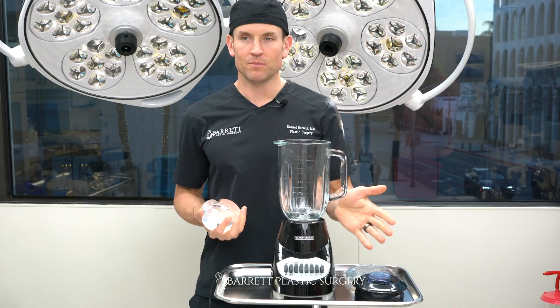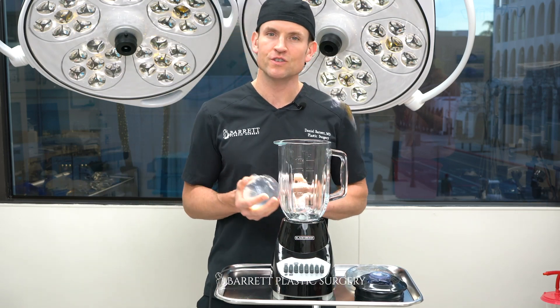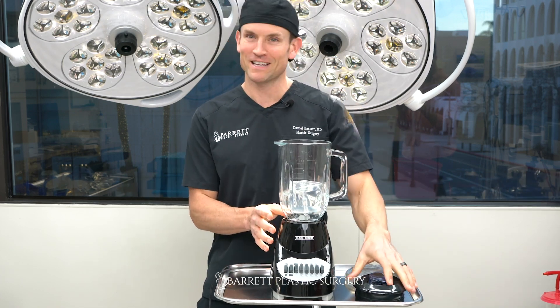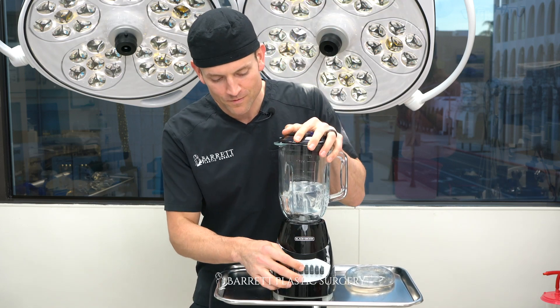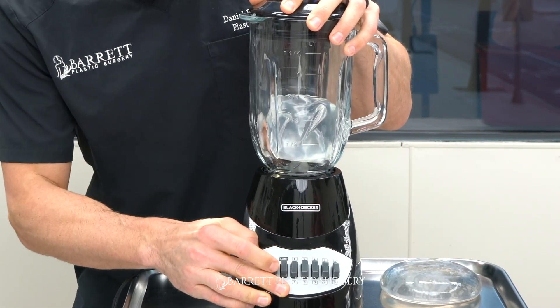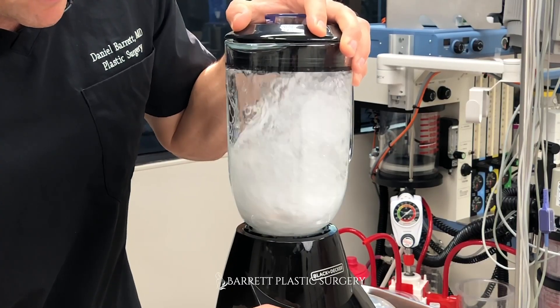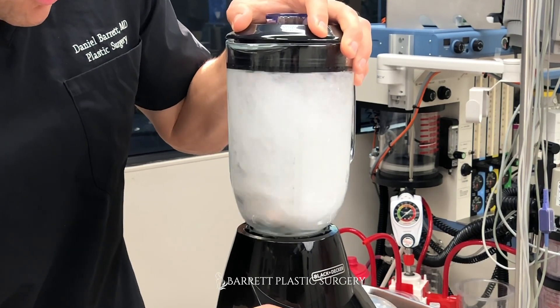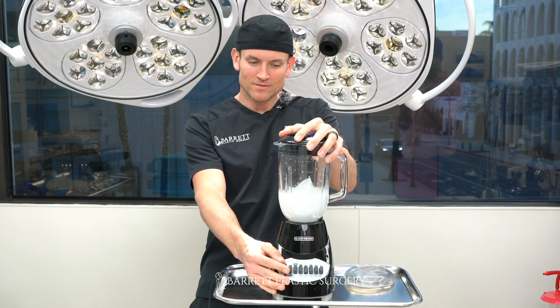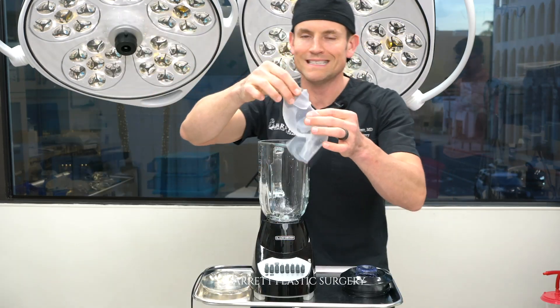For the final test, you guys — the blender. This is a Black & Decker high-powered blender. If this doesn't do the job, I don't know what else will. We're going to start with the saline. Here we go. Surviving the blender... Wow. Didn't survive the blender test, there you have it. This is what's left over of the saline implant.